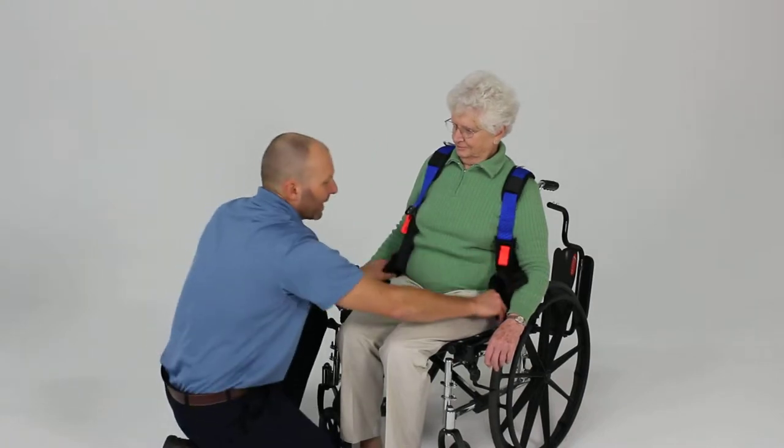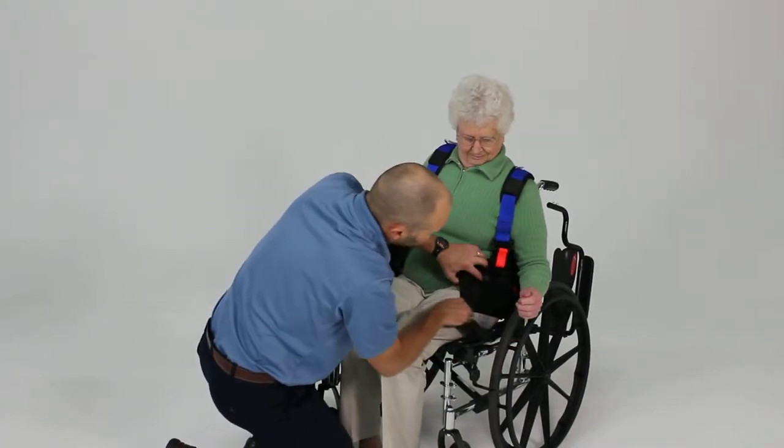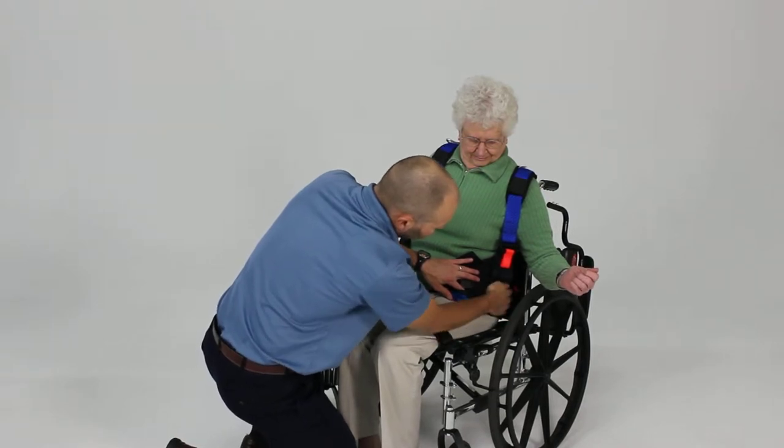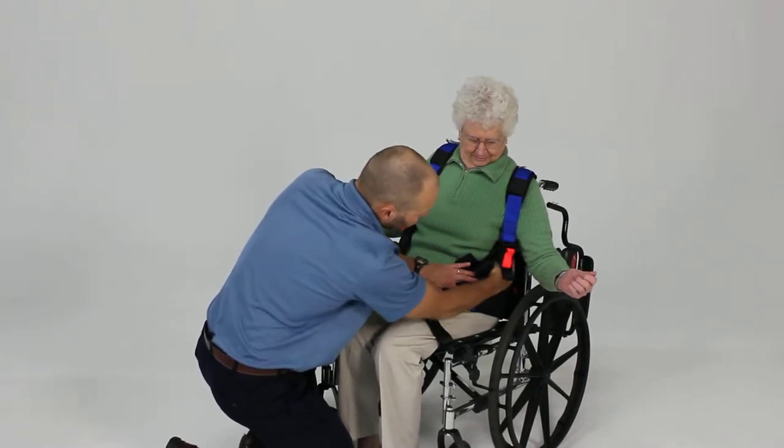We want to take the waist piece here and get it as low as you can, covering right across the iliac crest and under the angle of the ribs.